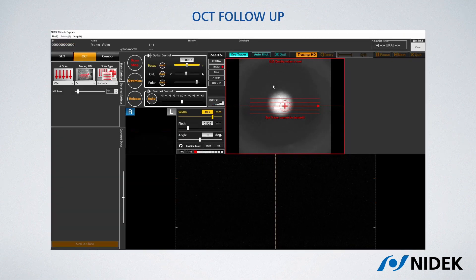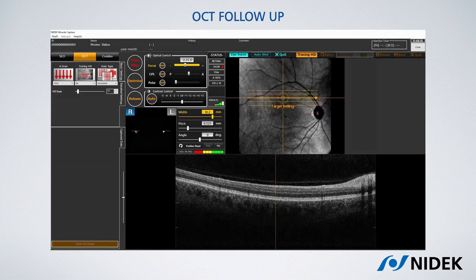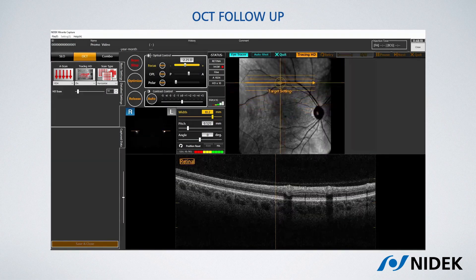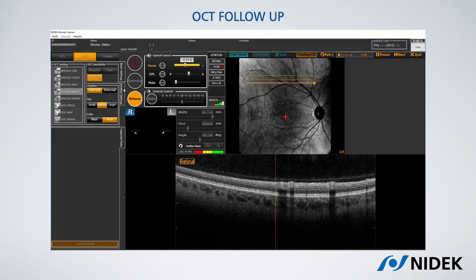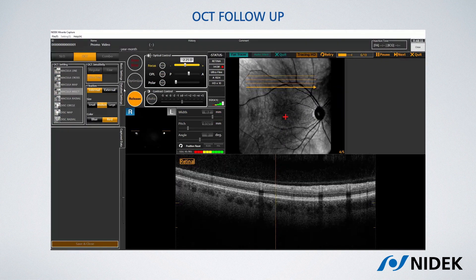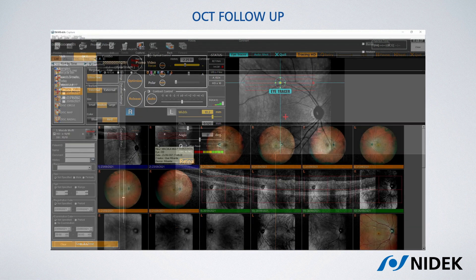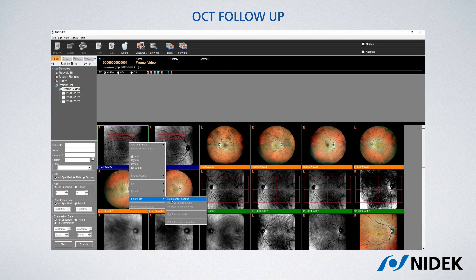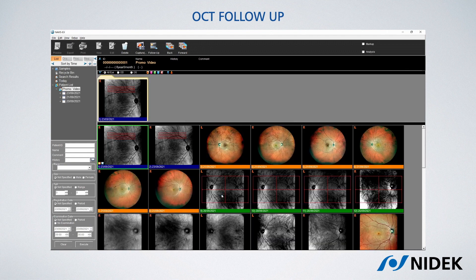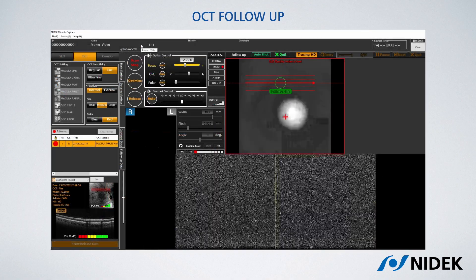In terms of reproducibility, let's see how easy it is to repeat an OCT scan in the same retinal location as a previously acquired examination. In this case, we're taking a first exam in a relatively peripheral area that wouldn't be so simple to find a second time. But thanks to the built-in eye tracking system, all we have to do is set the first examination as a baseline and then tell the system to repeat it.